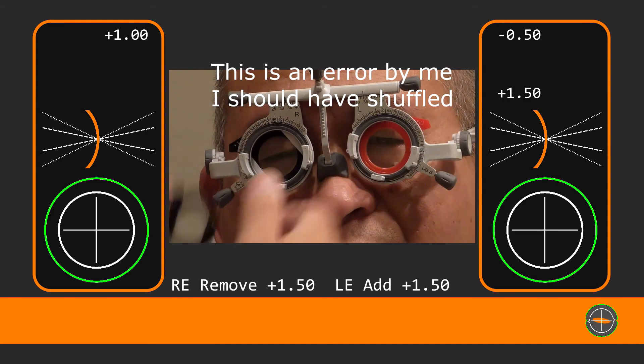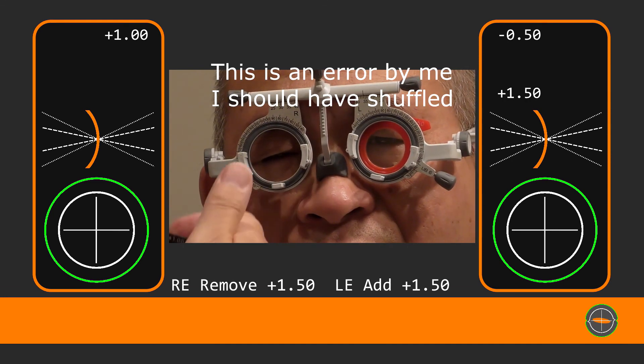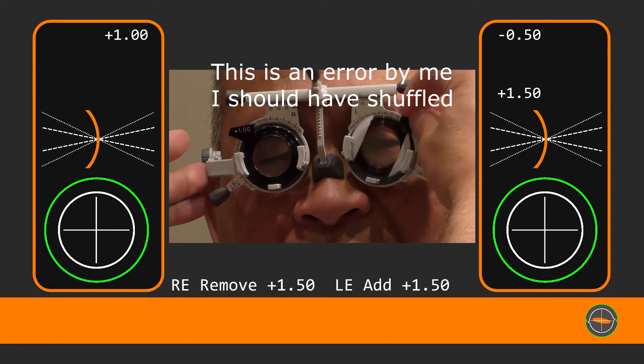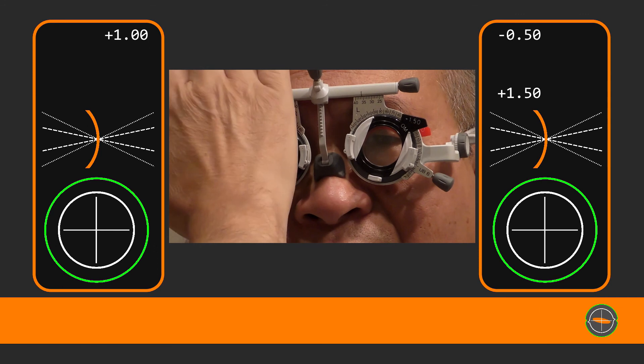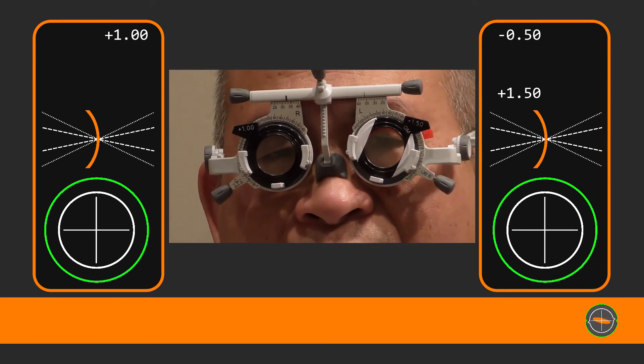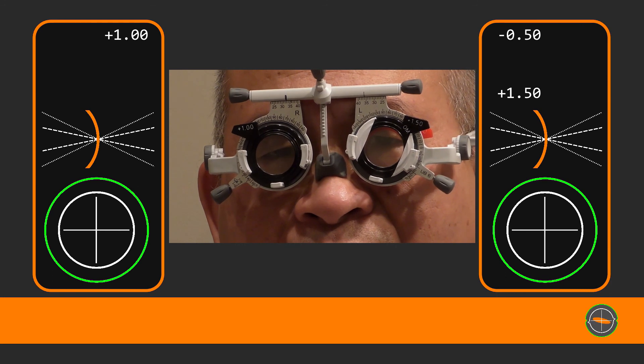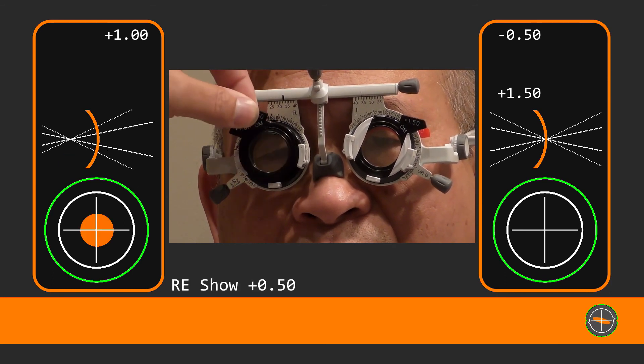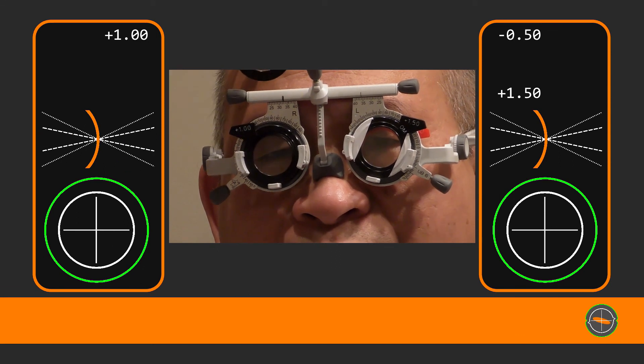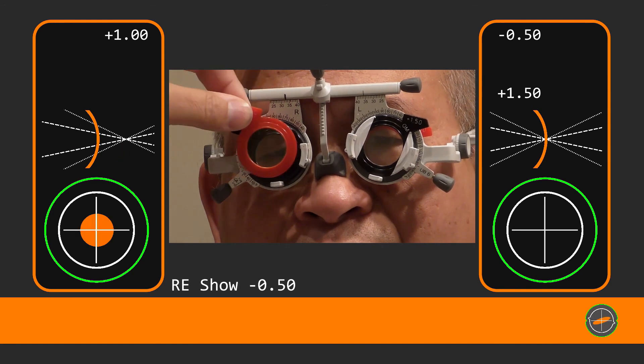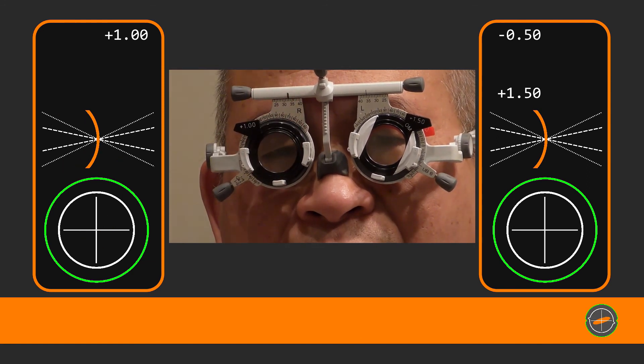So we'll just swap back over to the other eye now. And that's blurry there isn't it? And keep looking up there now. Better with this one or without. Without. And better with that one. Without.